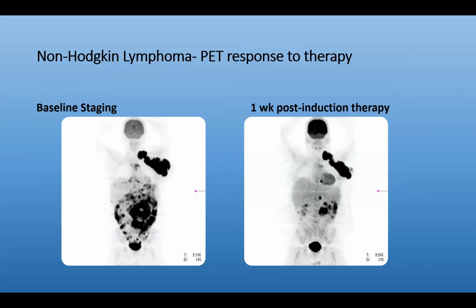Now, I'll just say that it's rare that they would order a scan just 1 week post therapy. But in this particular case, I guess they wanted to see what kind of a result or response the patient was having, because obviously he had quite bulky disease here. But the PET scan is quite valuable in demonstrating this positive response to therapy.